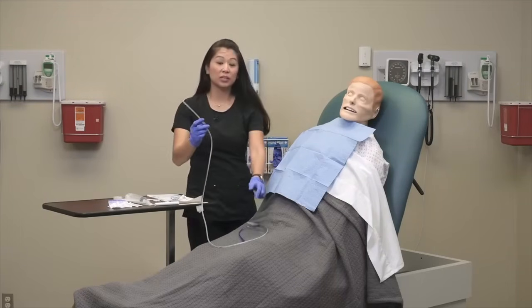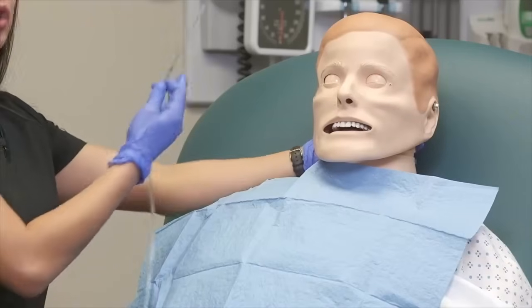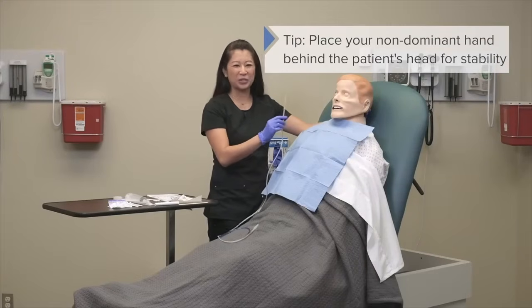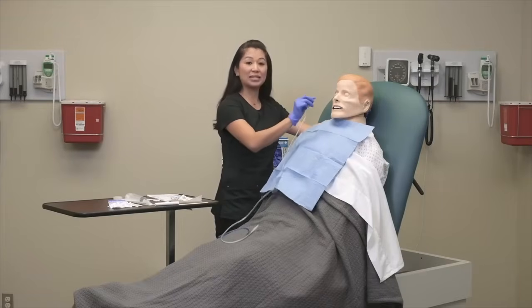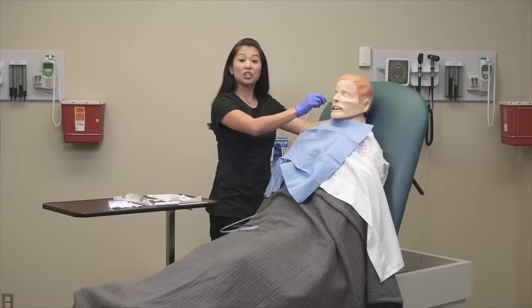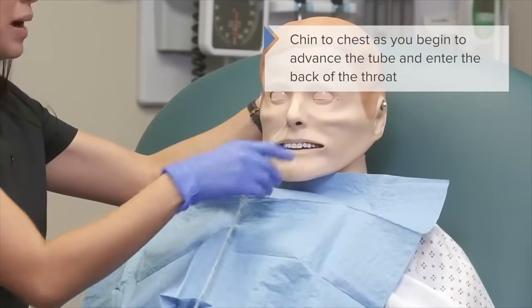So again, I've explained the procedure to my patient. When I do this, I want to make sure my patient's head is tilted forward. It's never a bad idea to put your hand behind the patient sometimes. They're going to naturally resist you when you insert the nasogastric tube, but I don't think this guy's going to resist me much. All right, so here's our nasogastric tube. I'm taking the tip, and I'm going to go down this naris. Once I insert and start feeding it in, this is a good time to have the patient chin to chest. So I'm going to move his chin to chest, and then I'm going to advance the tube, because remember, we're trying to get down to the back of the throat.